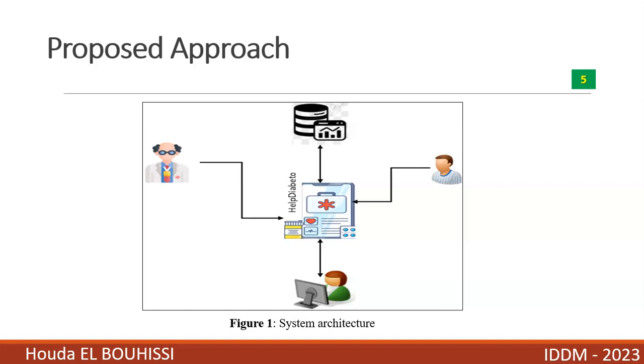The application involved three different user groups, as illustrated in the picture: doctors, patients, and administrators. Each user has specific functionalities and requires a password for access. The proposed application will be installed in a data center in the healthcare services and connected to physicians and patients' devices, like personal computer, smartphone, or connected devices.